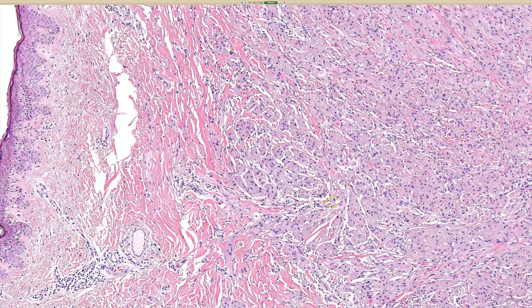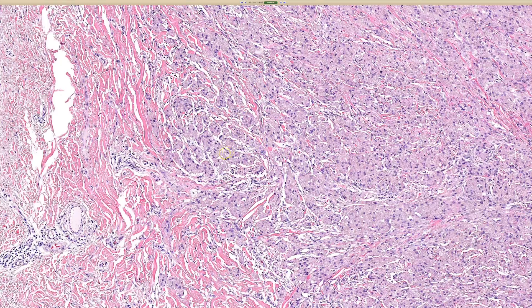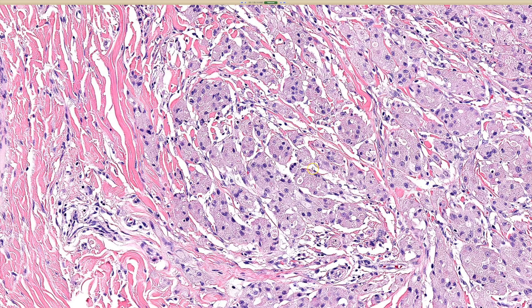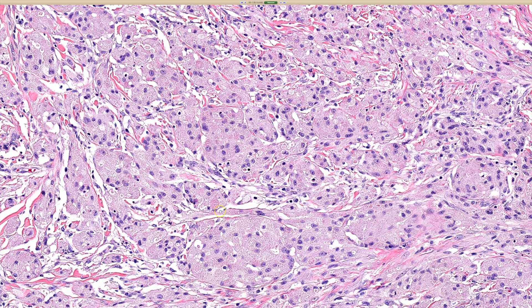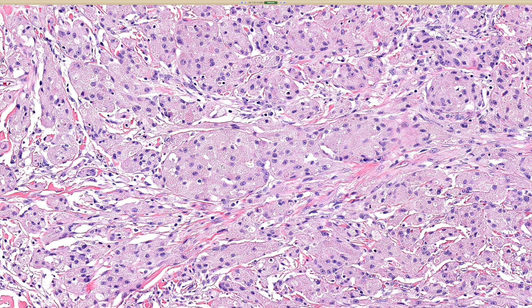In real life, this is an H&E diagnosis. There is another form of non-neural granular cell tumor that looks kind of like this — though it looks a little different. Both are benign. There are very rare malignant versions of granular cell tumor, but they're extremely rare. These cells could be confused with a xanthoma at first glance, but instead of bubbly vacuolated cytoplasm, they have more speckled, stippled pink dots in the cytoplasm.